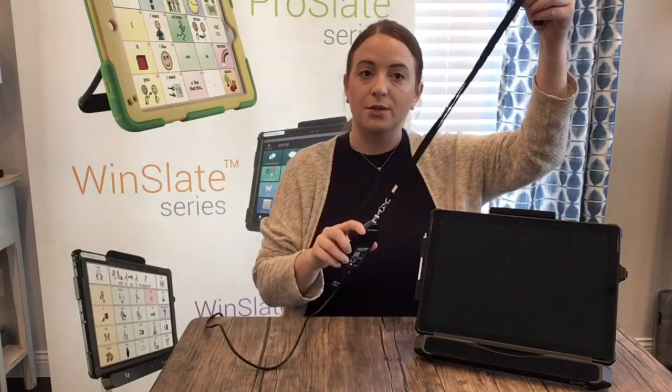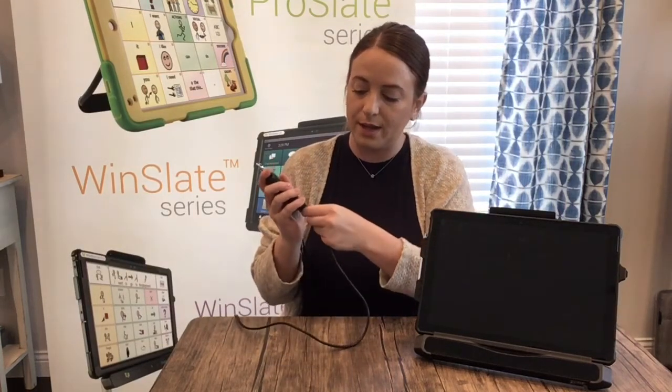Remember the lanyard we talked about in the unboxing video — that goes right into the top of the sound pod so you can wear it around your neck. I'm going to go ahead and unplug it. The orange light is no longer flashing, which means it's no longer charging.